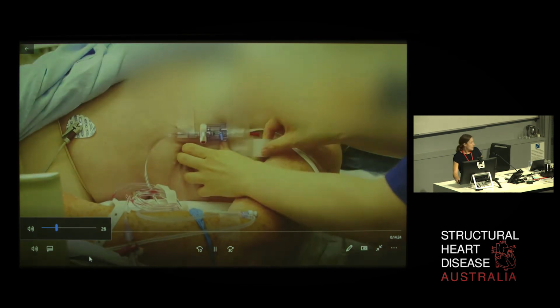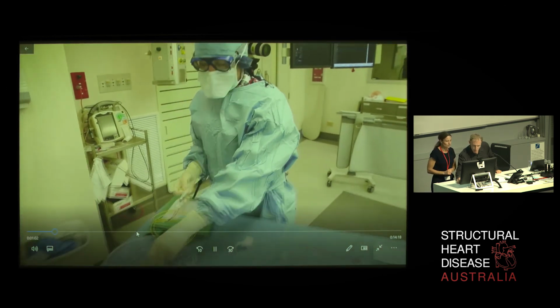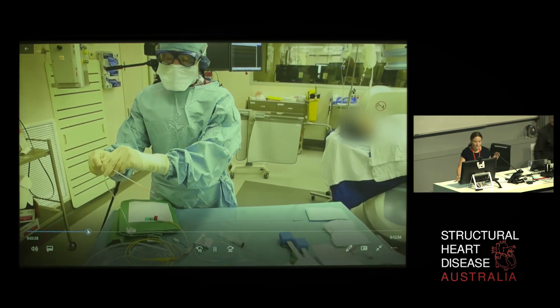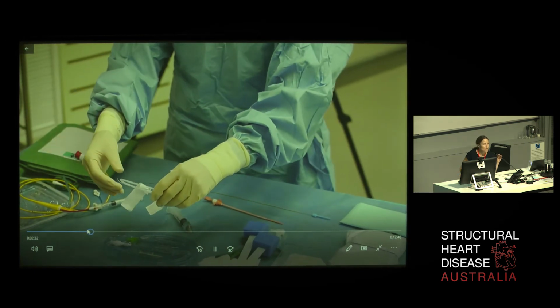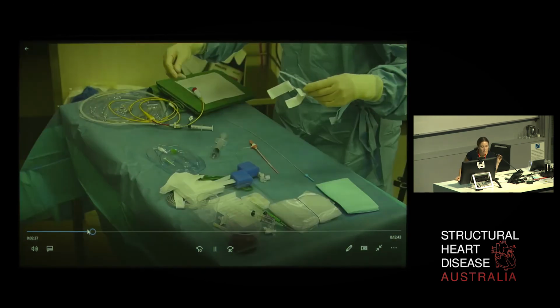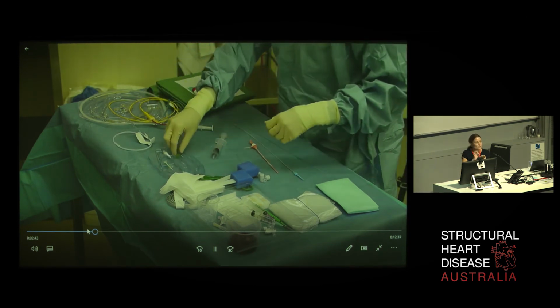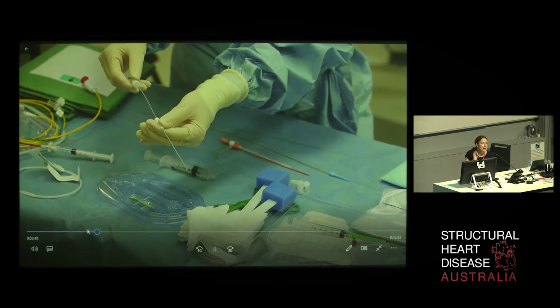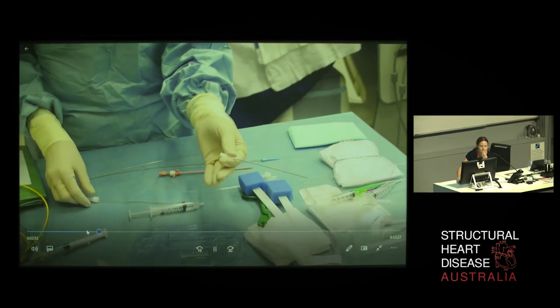Okay, so here we are sitting up for right heart catheterization. We have a 7 French Swan and a 7 French sheath. Drag that along to where you need to go. Okay, so essentially 7 French Swan-Ganz, 7 French catheter. This is the micropuncture technique, pulling out the wire there. You can see the other wire in the background there. And it's simply like doing a very, very small puncture with a wire, making sure you're in the right place, and then passing your Swan-Ganz through that kit. We've just removed this.